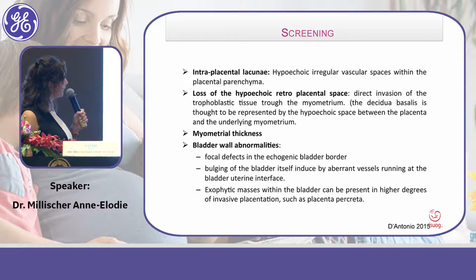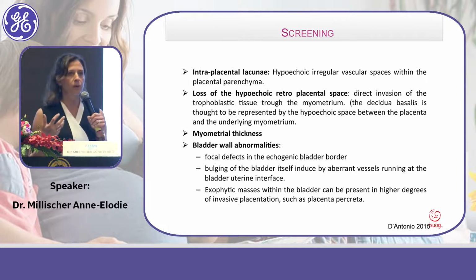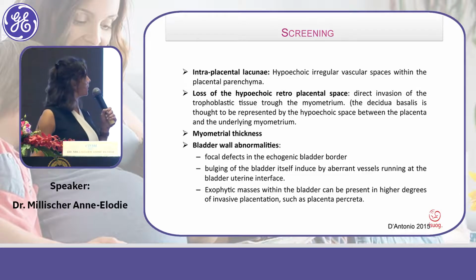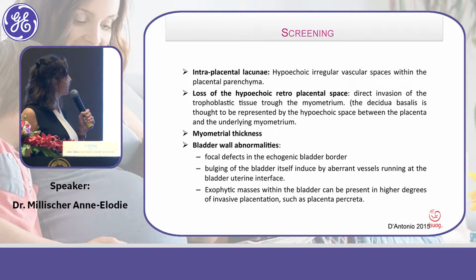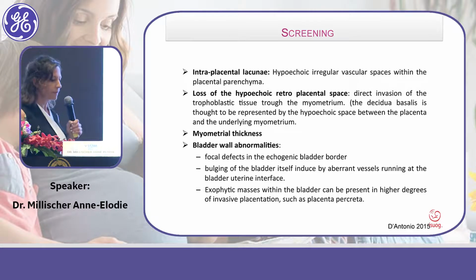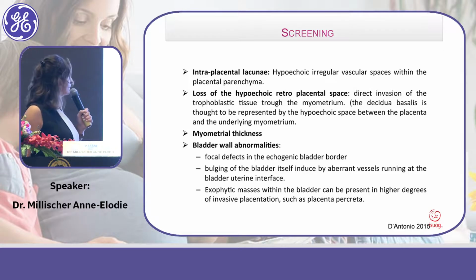Here you have little vessels just in the space between bladder and placenta, and there's a frequent hypertrophy of those vessels. Và các bạn thấy cái mạch máu nó đi qua nhau, nó bám tới gần tới bàng quang luôn. So the myometrium just in front of the placenta is very, very thin. Và cái cơ tử cung nằm ở cái vị trí mà nhau cài đó rất rất mỏng.